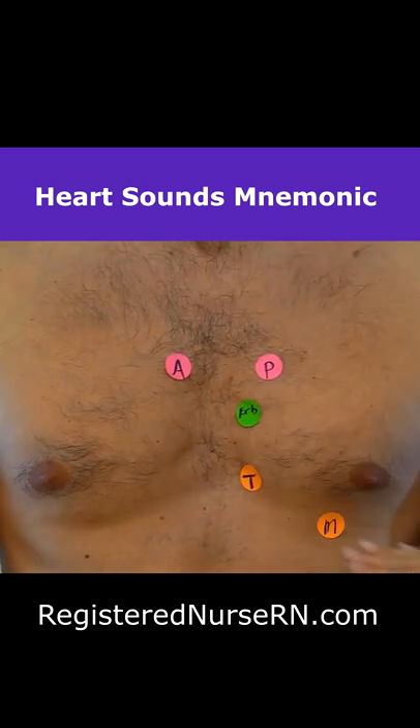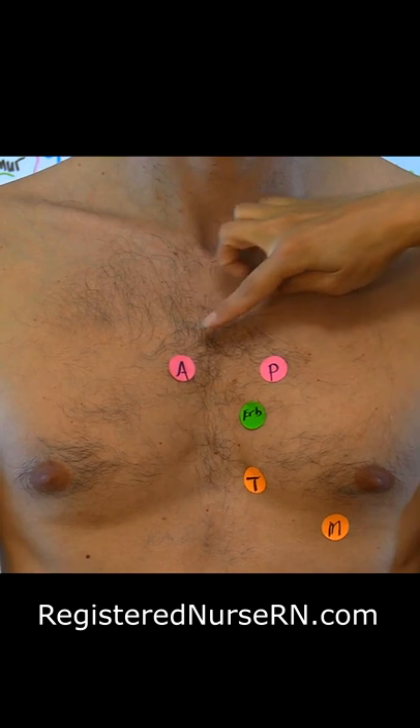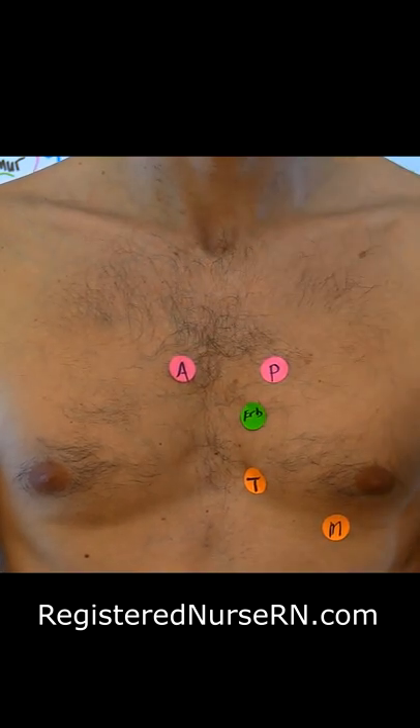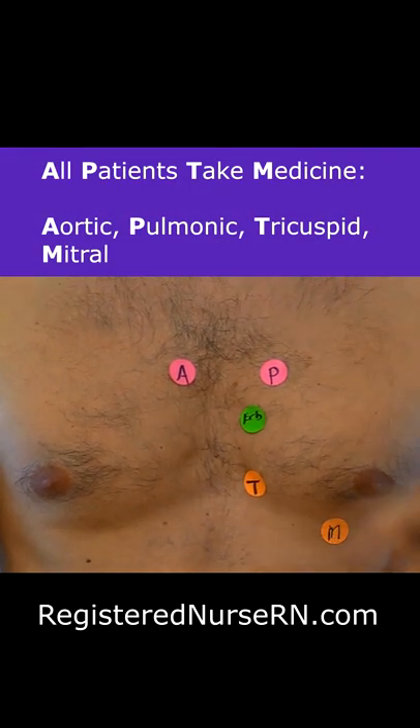First, I want to start out just showing you where you're going to actually place your chest piece whenever you're listening to the heart. I like to start in the aortic and work my way down. Remember the mnemonic: all patients take medicine.